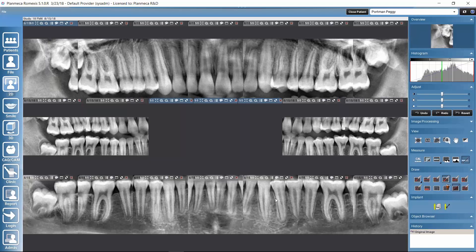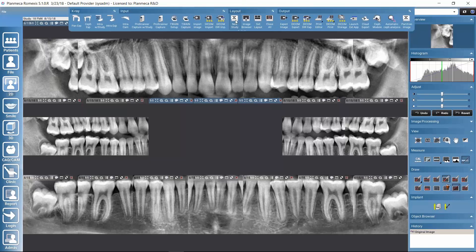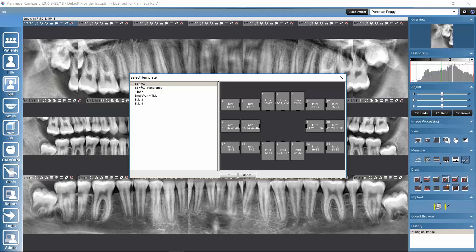Let's see how we can make a new study with existing images and how we can arrange images in the study. If I go to the upper toolbar and select 'New Study', first I can select which template I want to build my study on. In Romexis there are a couple of ready-made standard templates already, and I'll show later how to build a custom template if needed. I'll select the same template used in the previous study and click OK.